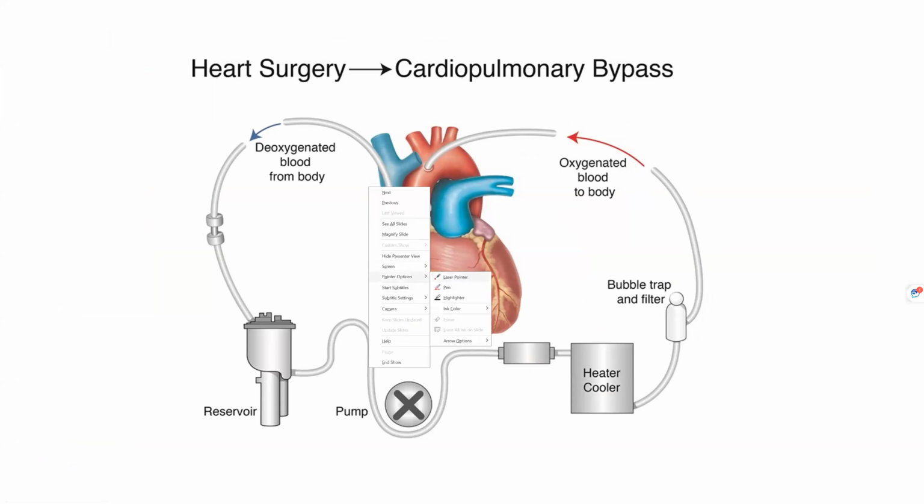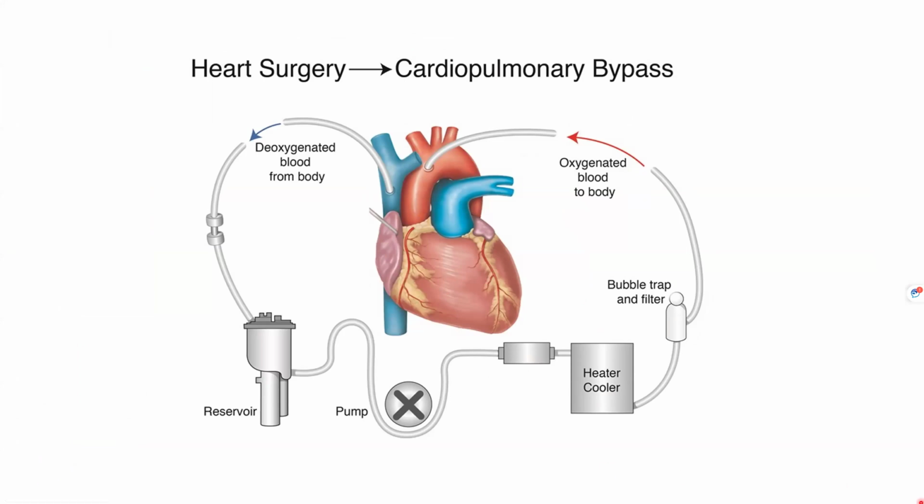Okay. Cardio bypass. Yes. So last time we went over in-depth about cardiopulmonary bypass and all its components. I'll just quickly summarize that the venous cannula drains your deoxygenated blood. It takes the blood through the reservoir, pump, oxygenator, heater, cooler, and the oxygenated blood is returned back via the arterial cannula. And the heart is completely drained and is empty. It's relaxed by giving cardioplegia. And both of the lungs are completely deflated. So the function of the heart, which is pumping, is done by the pump, and the function of lung ventilation is done by the oxygenator and heat exchanger.